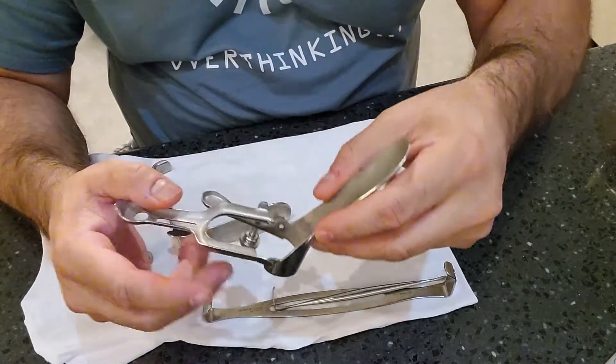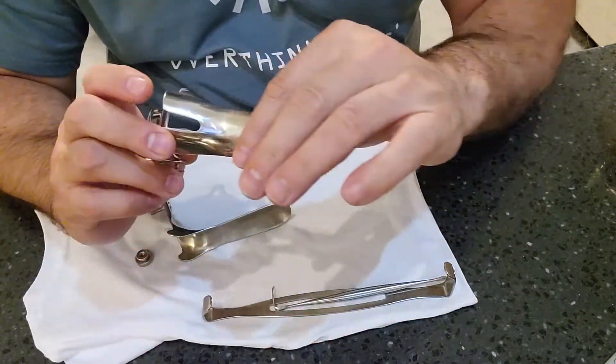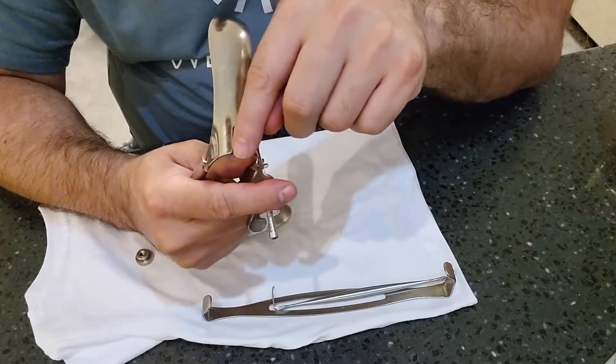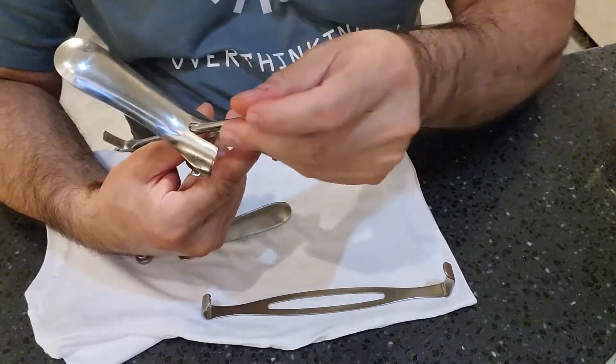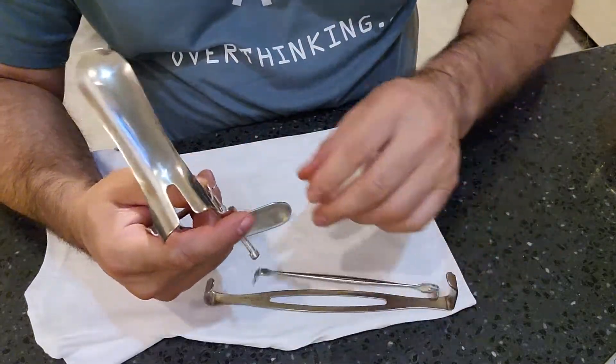Observe the inside track for any bio burden, discolorization, or damage. The upper portion of the bill or blade should be nice and smooth, as well as the instrument wedge line — this is designed to give instruments a little more area of play to work inside.